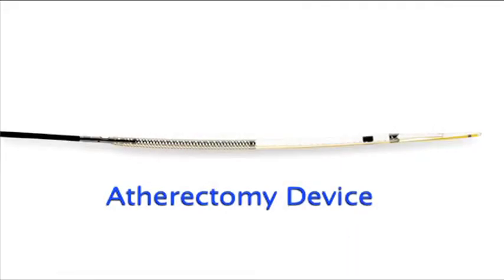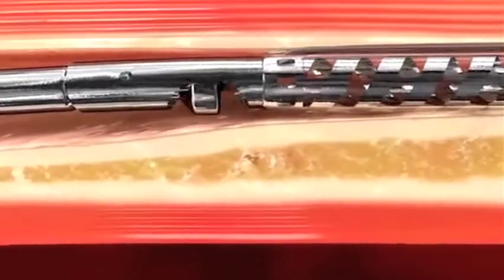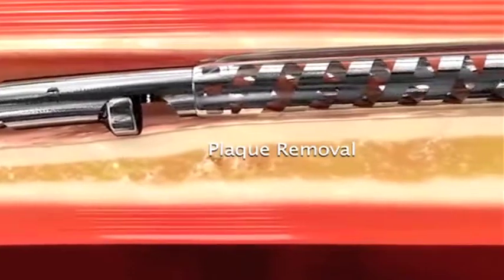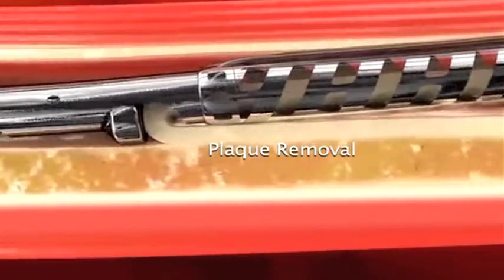This is the device that you'll see us using, called an atherectomy device. We're going to put a wire down past the blockage and then feed this device over that wire to shave the plaque out of the artery and remove it from the body. In many instances we do not need to use a stent.